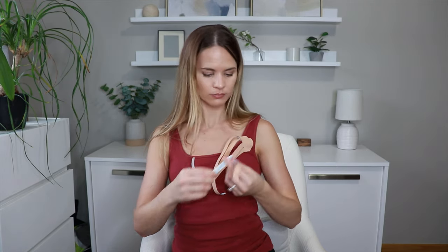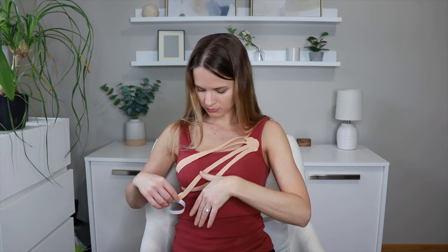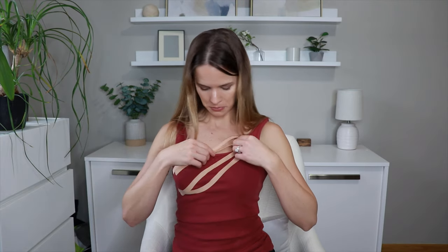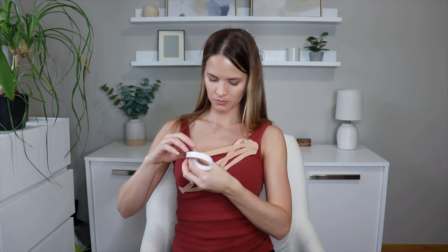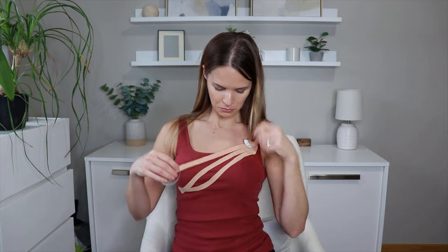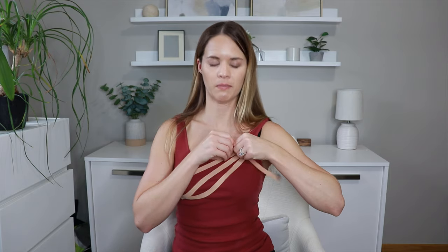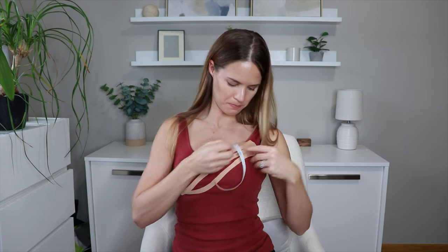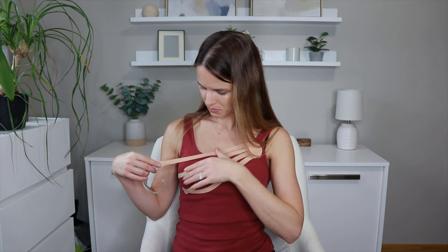Then do the same thing with the next strip: give a little inch or two at the end without tension, pull a little tension, guide it across, no tension at the end. Do the third and then the last one, then lay them all down. Once you're done you can go back and rub that all in to make sure all the adhesives are warmed up.